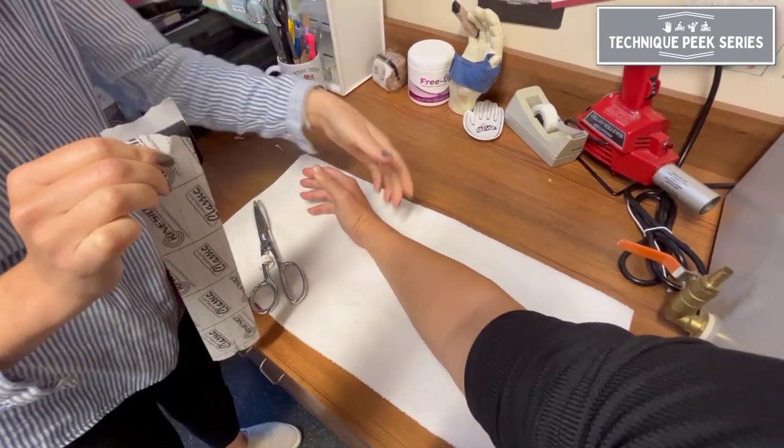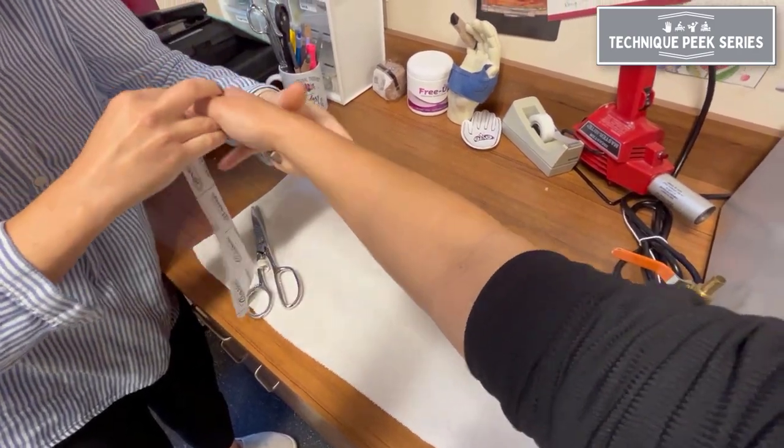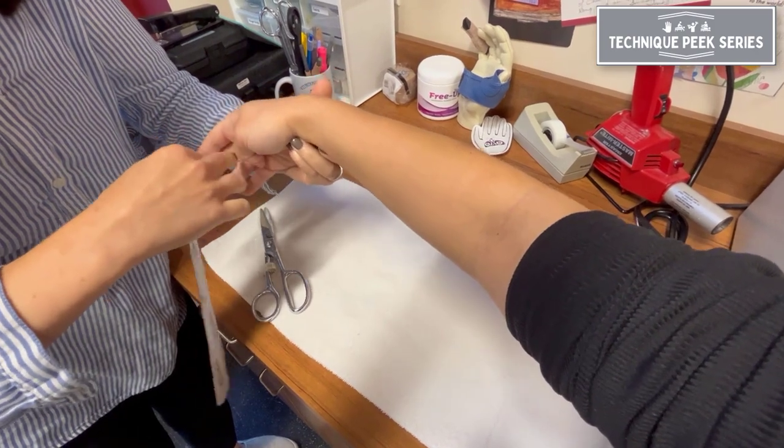Position the patient with thumb flexion, wrist flexion, and slight ulnar deviation before applying the tape.